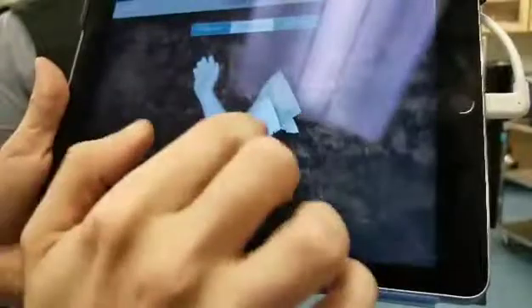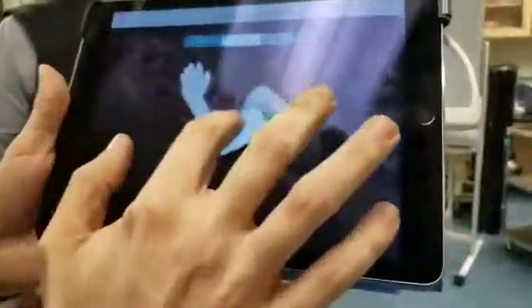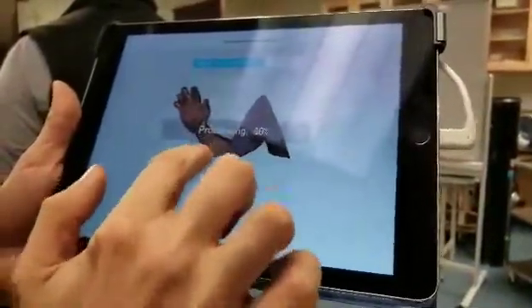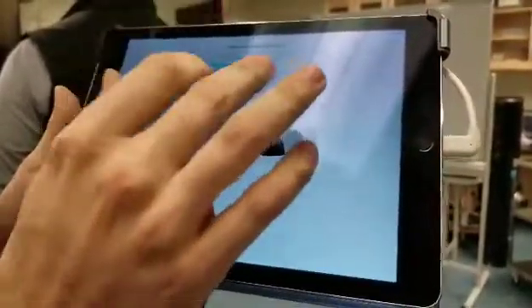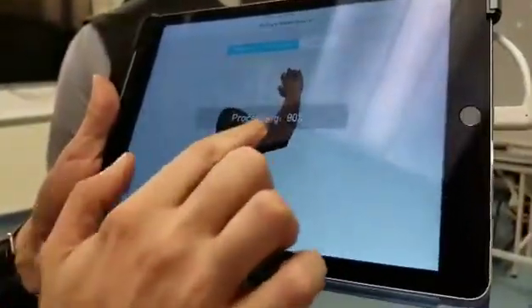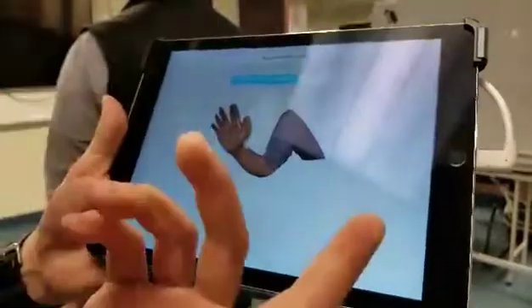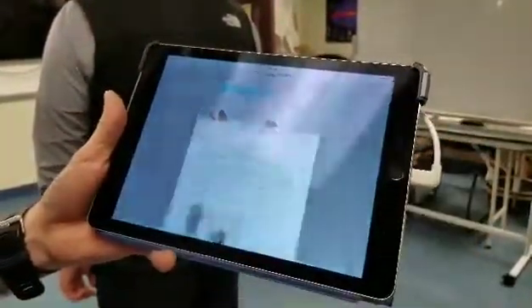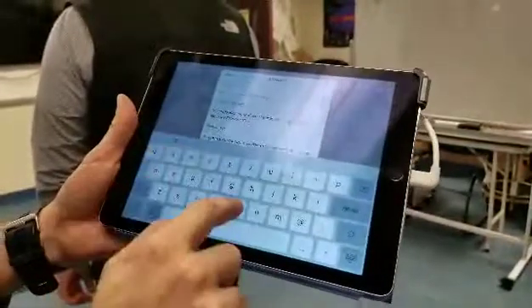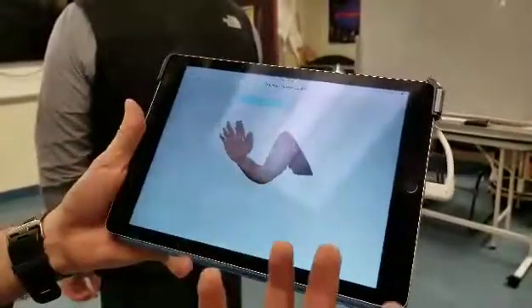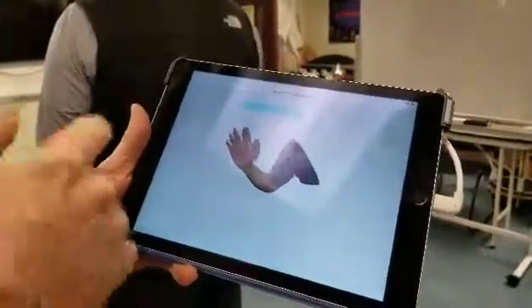If you needed the whole elbow, you'd have to make your bounding box a little bit bigger. That's the shaded view. We can also do a color view and that'll show you the color camera output. The color is not perfect — there's a little bit of parallax between the color camera and the 3D scan. But this is a good enough model that we can read it into MeshMixer and actually get a scan. The big problem with this particular Structure app is you can't save this model directly — after you scan it, you need to email it to yourself. So you get your good scan, check and make sure you get that email, and then you can start working with it in MeshMixer or whatever your favorite 3D scanning program is. We use the Structure Scanner to get scans of arms.